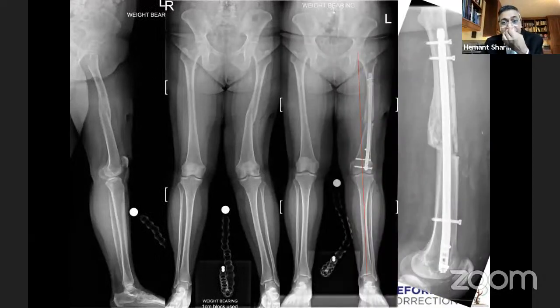And these are some of the examples. There's an example of a femur, and the idea is that there's a polar screw here, and what this polar screw does is it guides your nail. And the reason I'm showing you this is because if you see, the entry point is a bit lateral. So we planned and knew that the entry point is a bit lateral. So we put in a fixator assisted correction, put a polar screw, and then started with that starting point, which was lateral.